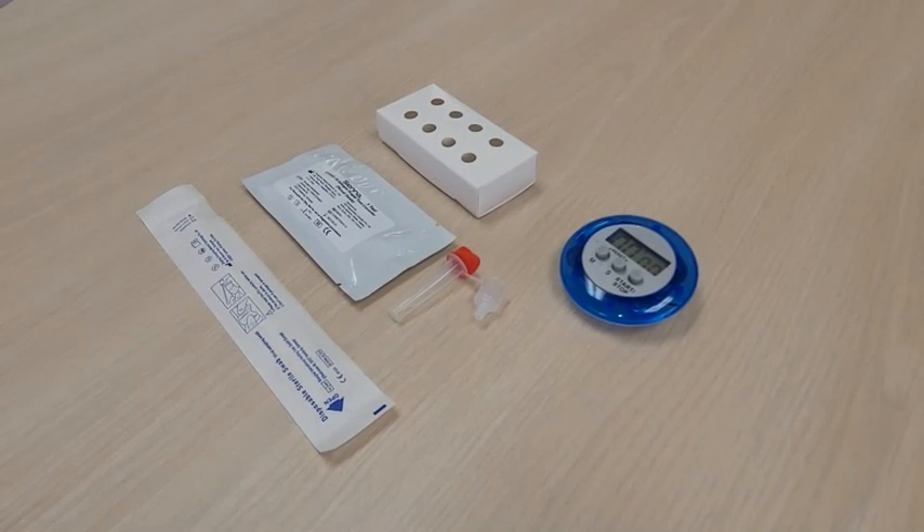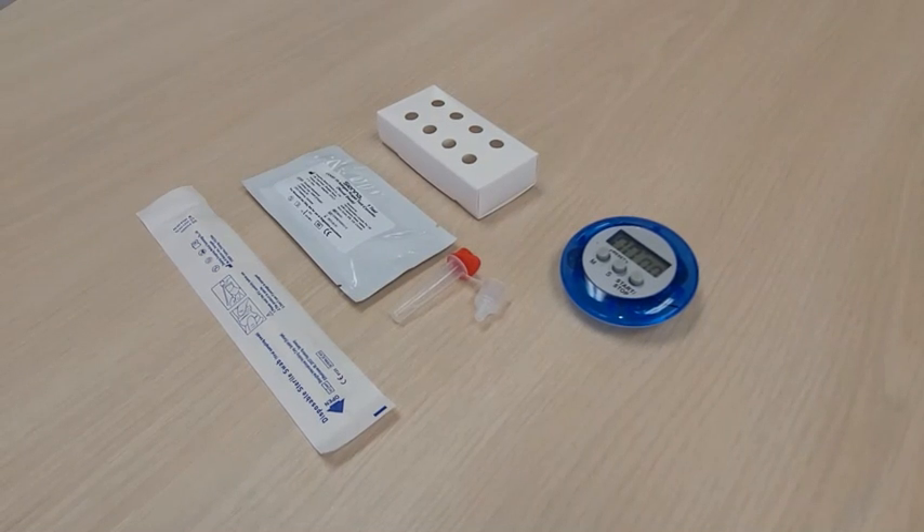Before you start, make sure you have the following items ready: the Sienna COVID-19 Antigen Rapid Test Cassette.